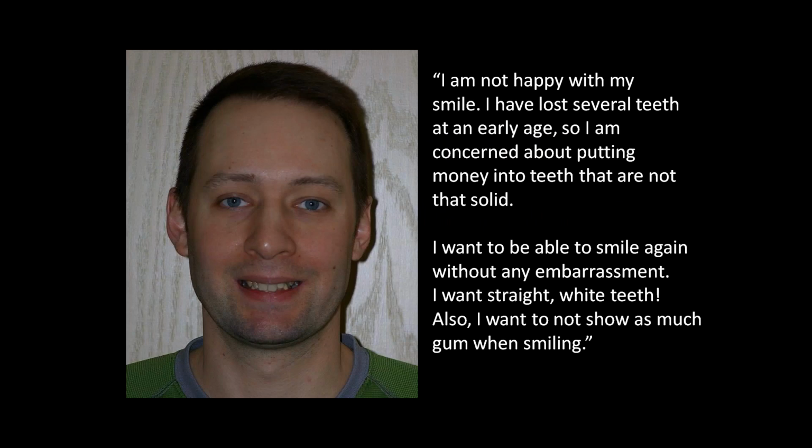Here we have a patient that presented to my practice, and he said that he's not happy with his smile. He's already lost several teeth at an early age, so he's concerned about putting money into teeth that are problematic and the prognosis is not very good. He also tells us that he wants to be able to smile again without embarrassment with straight white teeth. And he knows that he shows quite a bit of gum when he smiles. So as you can see from this profile shot, he's not smiling very big and his eyes tell the whole story.